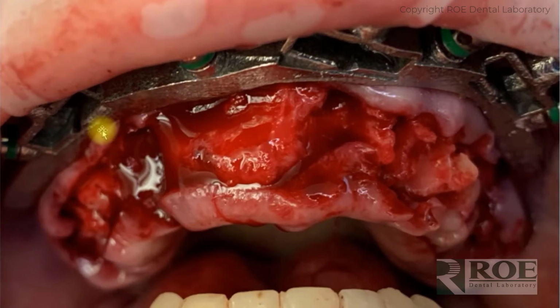It's a little irritating for the patient. The healing will be a little slower because of it. But I'm sure the philosophy here is maintaining the blood supply to the bone by not doing a full reflection.